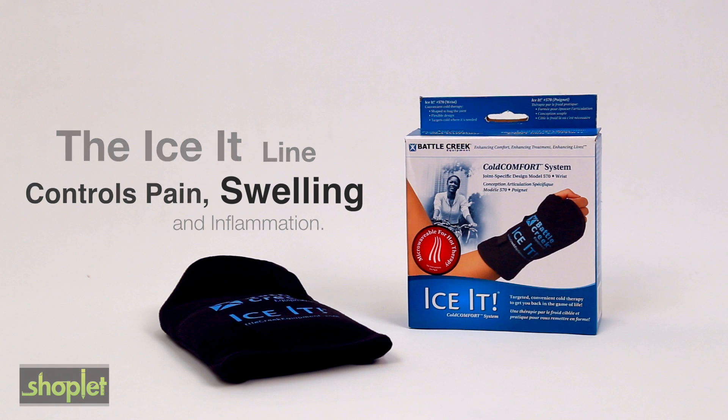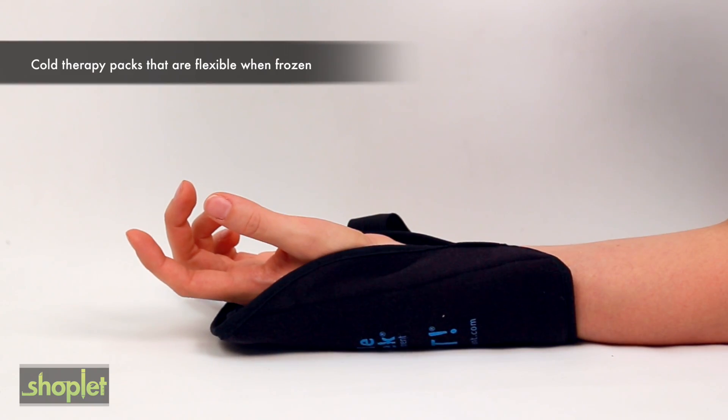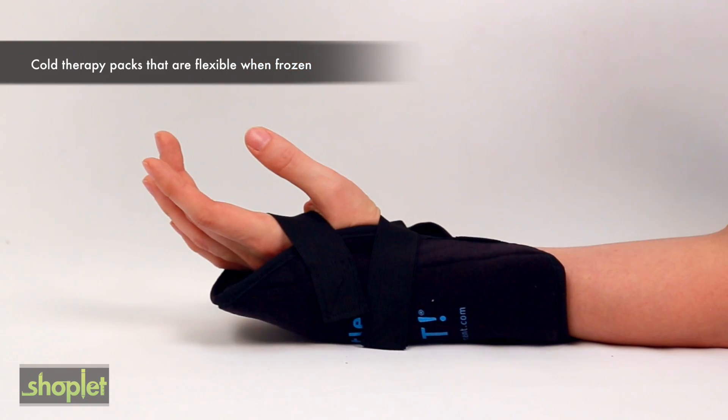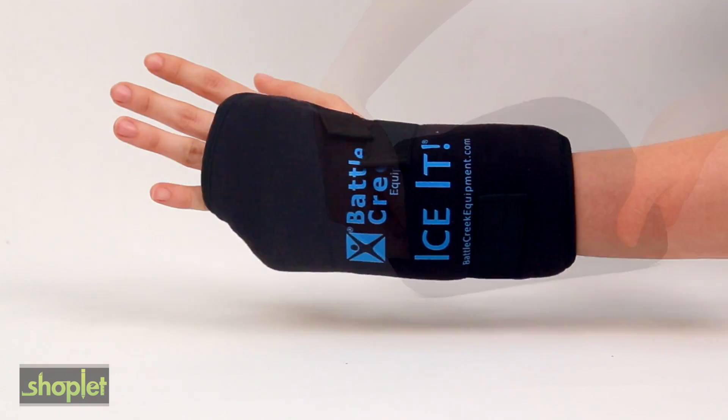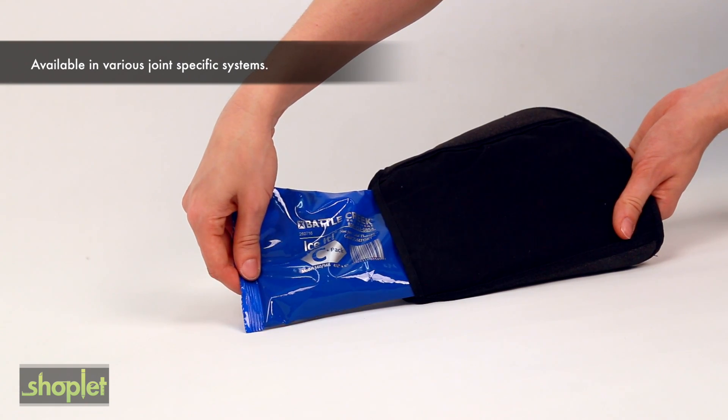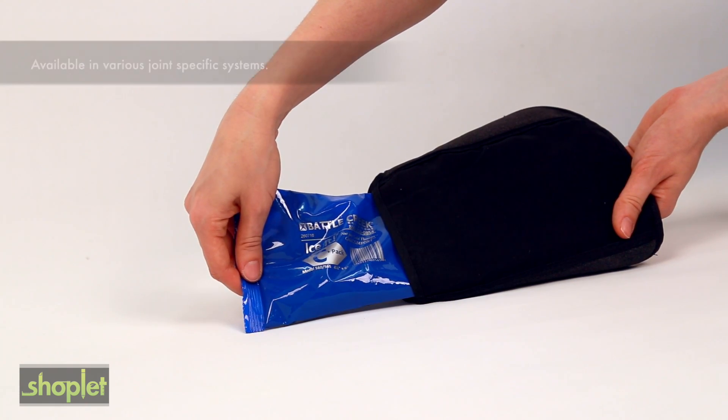The iSit packs deliver cold therapy and are designed to effectively cover the affected area. These packs are flexible when frozen and provide uniform contact with skin. The iSit line provides hands-free convenience and comfort and is available in various joint-specific systems.